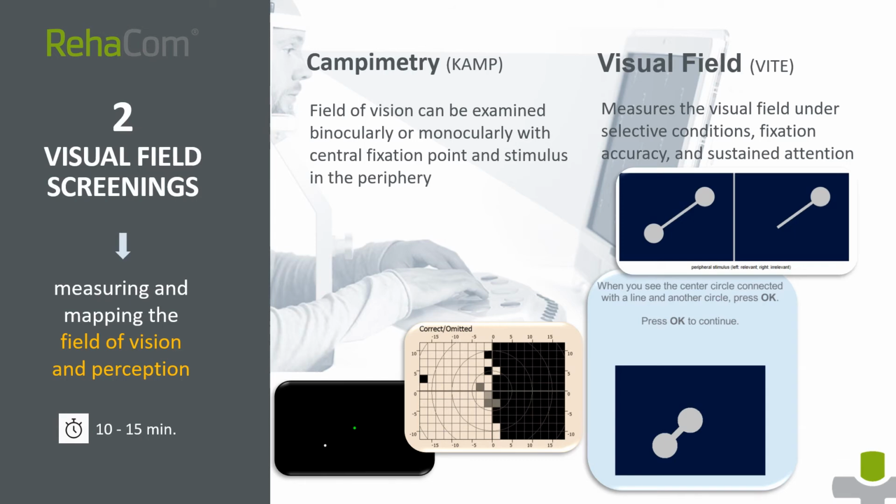In both tests, the patient must look straight ahead at all times in order to accurately map the peripheral visual field. To control the fixation, a fixation point changes color or shape randomly. The change should be confirmed as rapidly as possible.